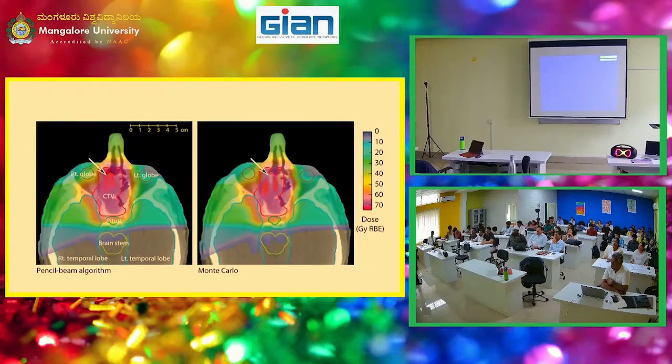The area is pretty good in terms of where, but it's just not as precise. So there's another example of how AI can be helpful, because this is very computationally heavy. If you can improve that process with machine learning, fantastic.